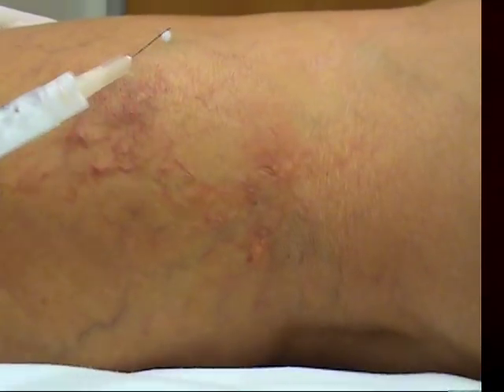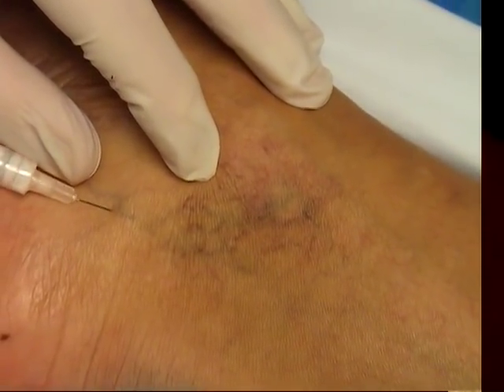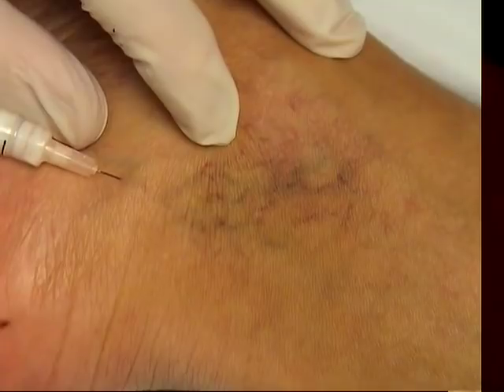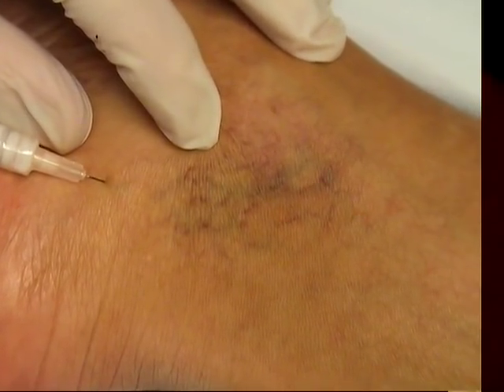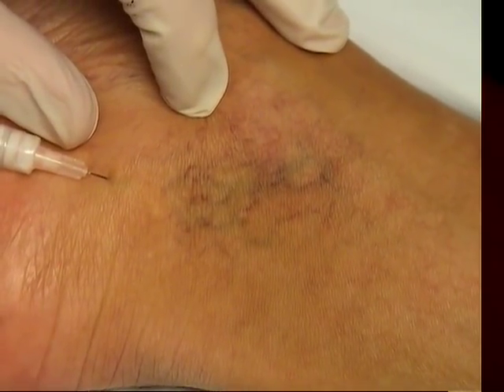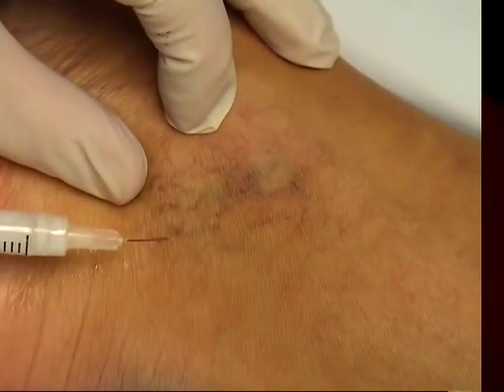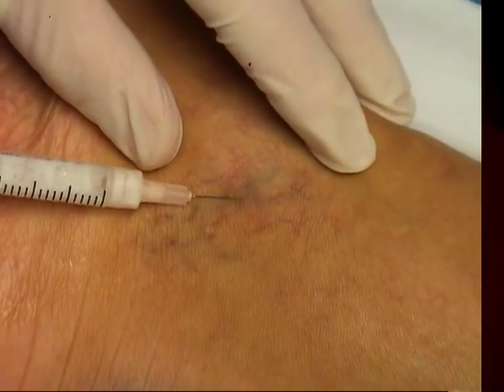I think that's looking very nice. That should be fine. A little needle — keep very still. I'm okay, I'm still. I'm not going anywhere. You okay? I'm fine. I think my next time I come in I'll be good — I'll be better. You just know what to expect.